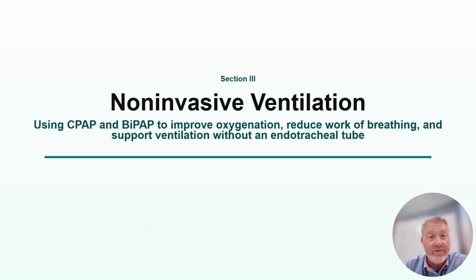And for ventilation, if you get a blood gas back and it's 7.30 and 50, and we want to increase ventilation because they're under-ventilated, the high flow interface itself is not good for correcting acid-base imbalances. Can it have a small effect? Sure. Does it have a measurable effect? No.